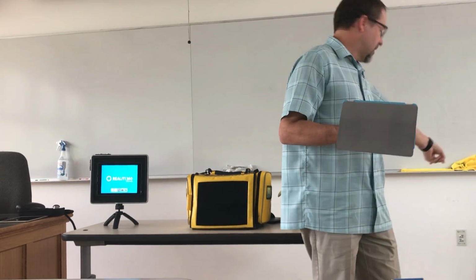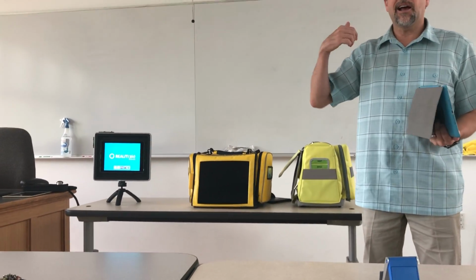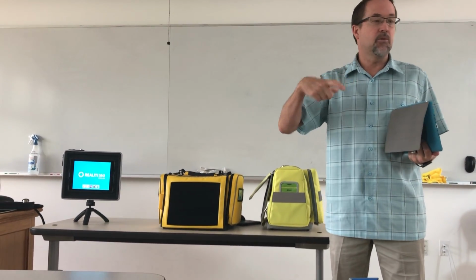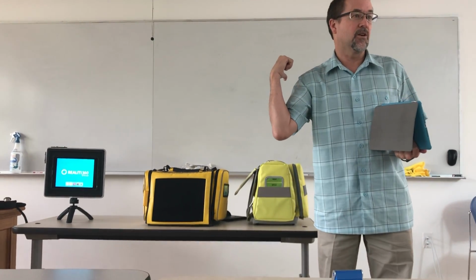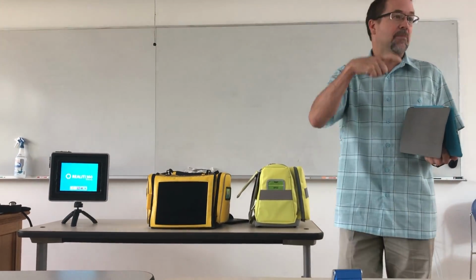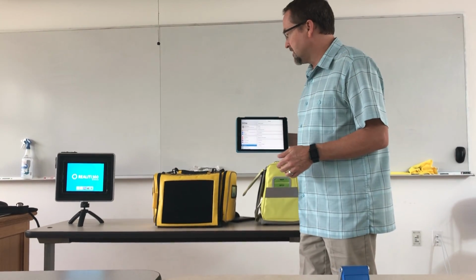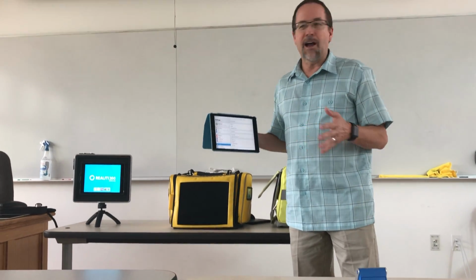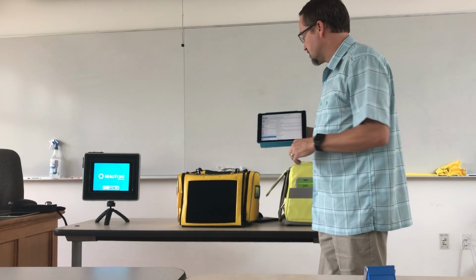For each bag. Each bag comes with its own router, its own battery pack. And the battery pack that I saw at whichever conference, I think it was at the NAMSI, the last place I saw iSimulate had a booth, they have a new battery now that supposedly has a longer battery life and is half the size of this one. So the pack you guys are getting may have a much smaller battery. It may not be the same router. They're continuously tweaking and upgrading stuff as it comes out. And these guys have a pretty good deal with Apple and purchasing, because they literally buy iPads by the pallet. So they kind of have a good purchasing system in place.